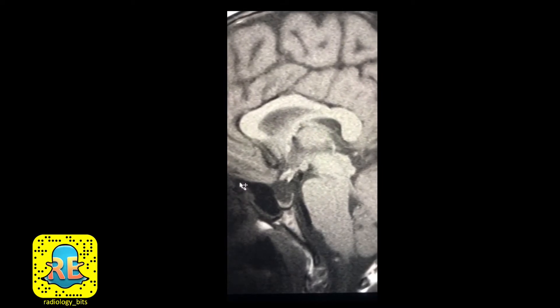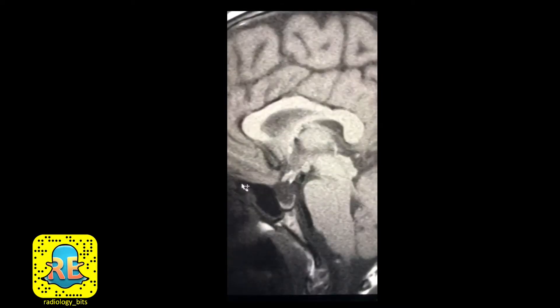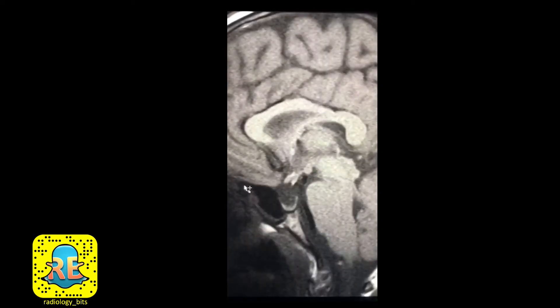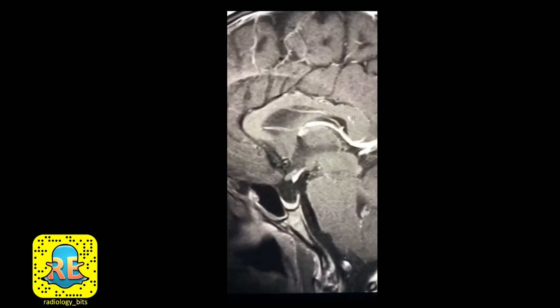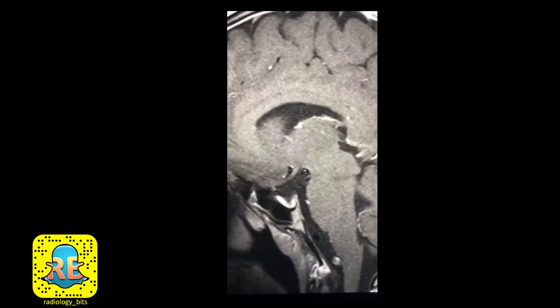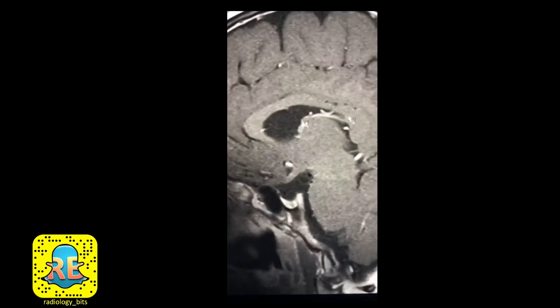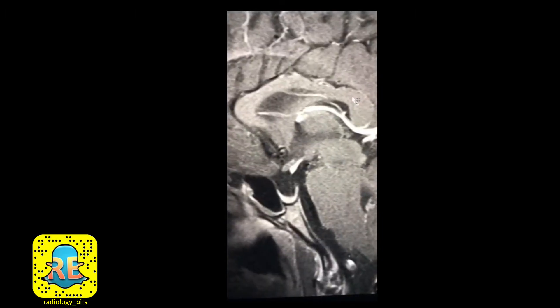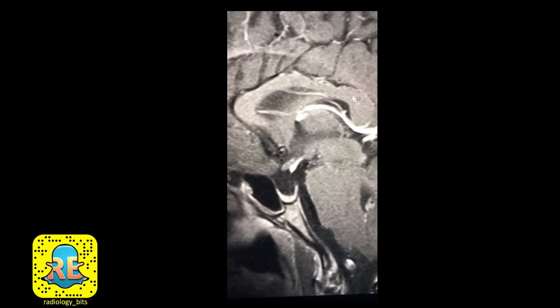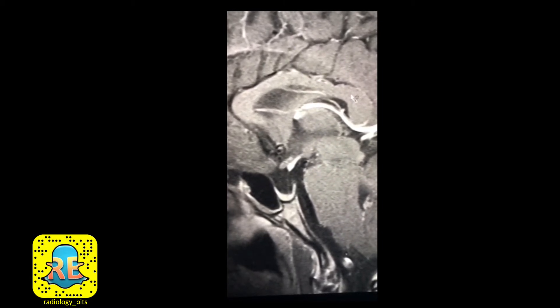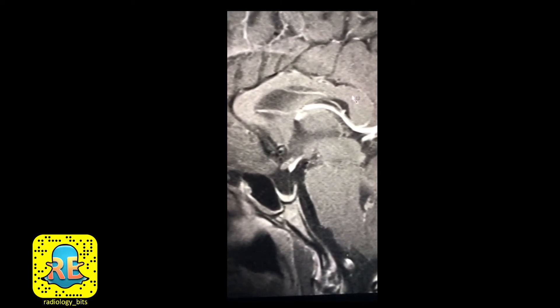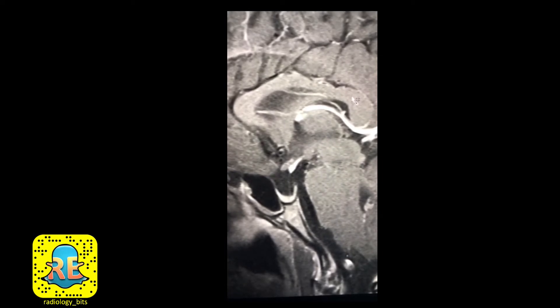Here's the pre-contrast T1 image, and this is the same type of imaging after giving intravenous contrast. To better understand the anatomy in this area, in the next section I'll post a link to one of the earlier radiology bits tips and tricks. I'll ask you to pause, look at that link, understand the anatomy we'll talk about, and then we'll continue after that.